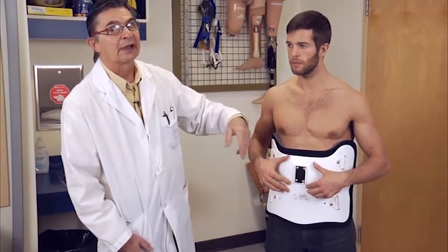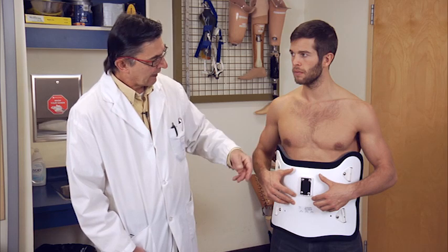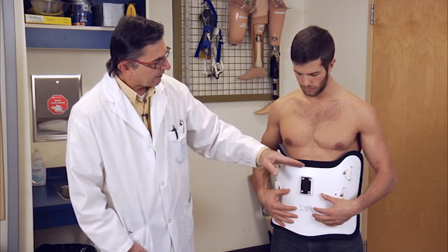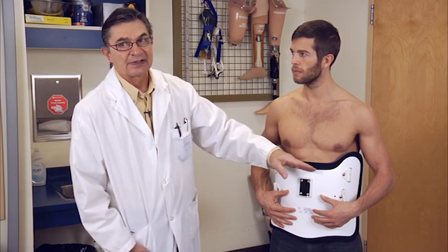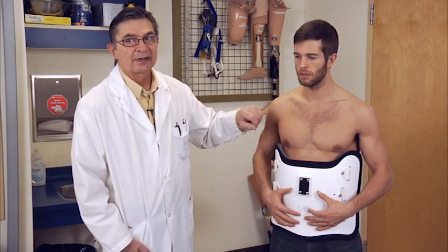If it's a female patient, you need to know their bust size. You want the border of the anterior piece to be low enough so that it's not digging into the breast tissue. Are those measurements circumferential or diameter? Circumferential — we need circumferential measurements.